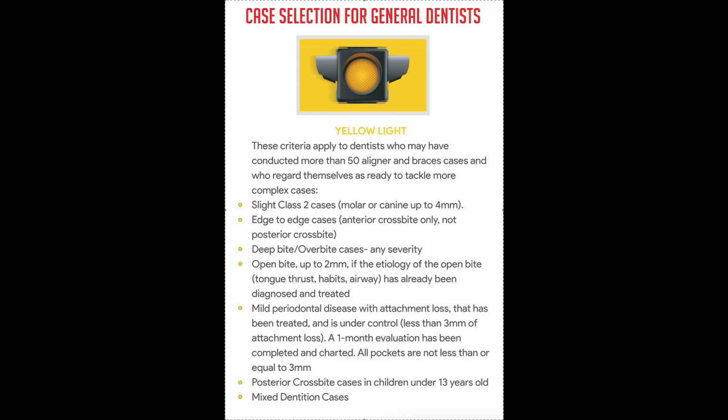And a lot of times these dentists are asking me to help with their cases, and I'm like, I don't have x-ray vision. I don't know what the right thing to do here is. Most orthodontists take cephs as standard on every single patient, just in case we need to refer back to it, and also for standard of care.